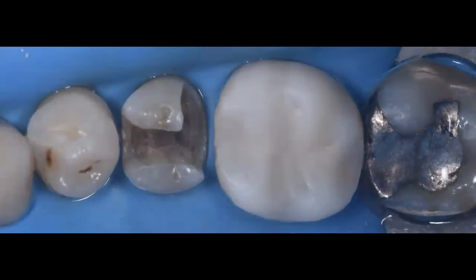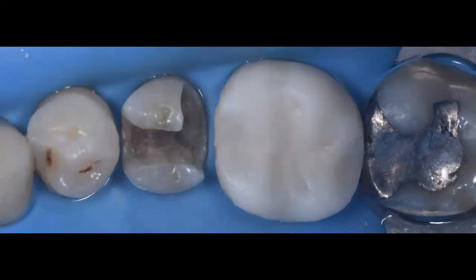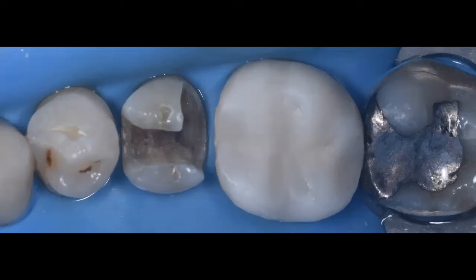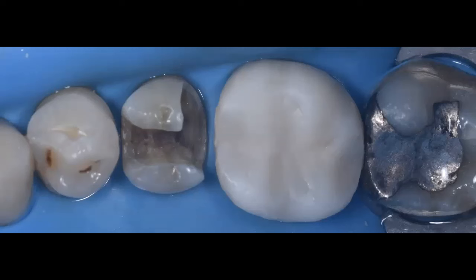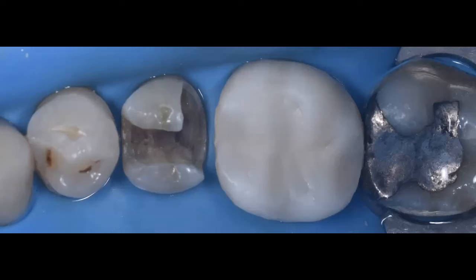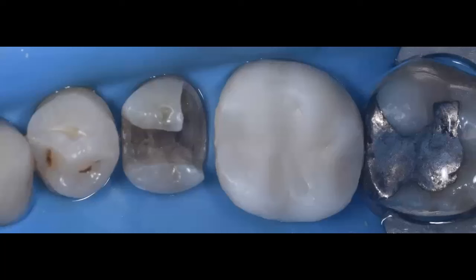I'm an advocate of rubber dam isolation and I truly believe in its benefits. I isolated the tooth and removed the amalgam under rubber dam. I did not know initially how deep that distal margin was. When margins are below the gingival margin with no enamel remaining, that is the ideal situation where margin elevation is needed — that is one of the key criteria for margin elevation.